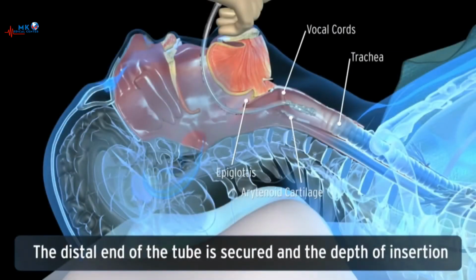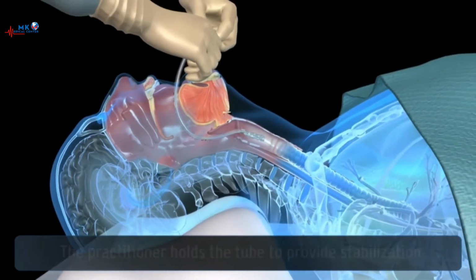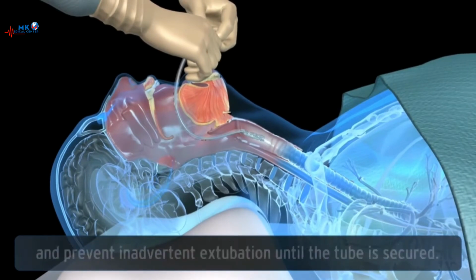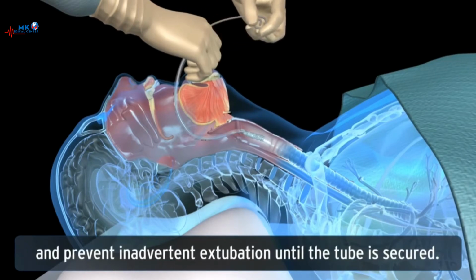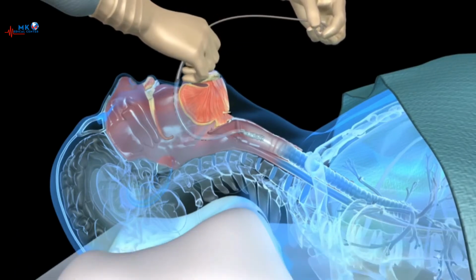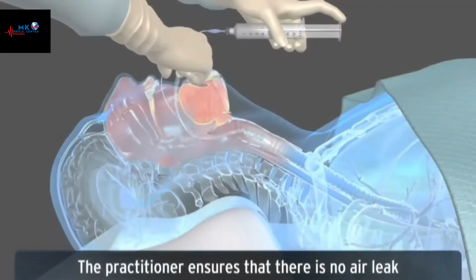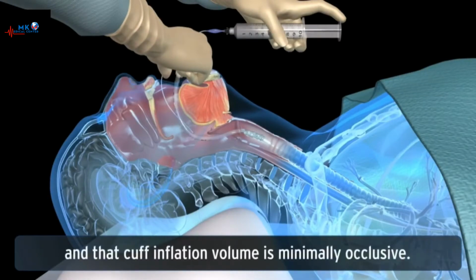The distal end of the tube is secured, and the depth of insertion is noted at the teeth or gums. The practitioner holds the tube to provide stabilization and prevent inadvertent extubation until the tube is secured. The practitioner ensures that there is no air leak and that cuff inflation volume is minimally occlusive.